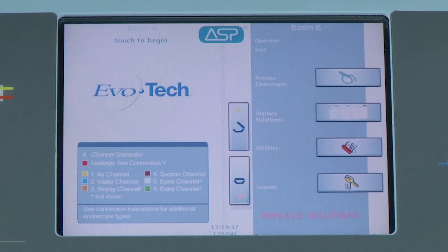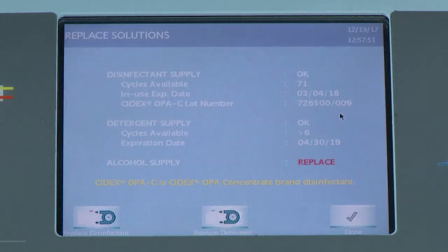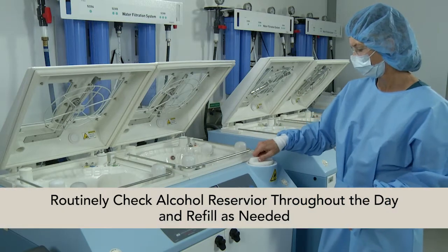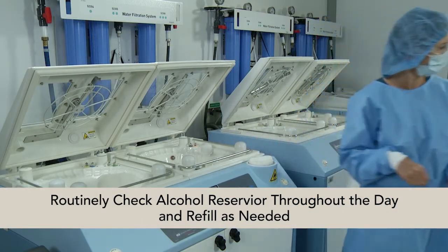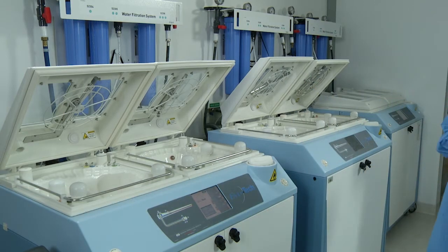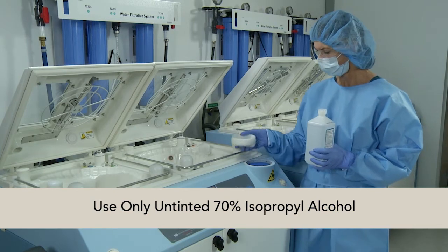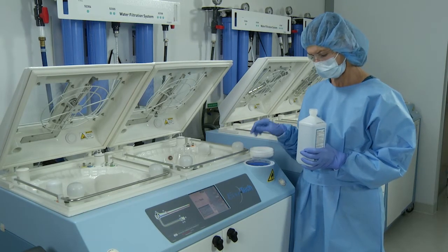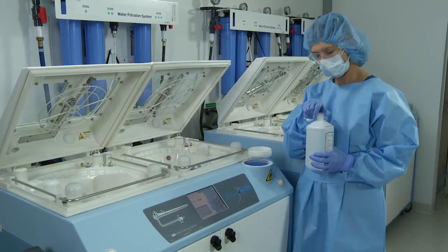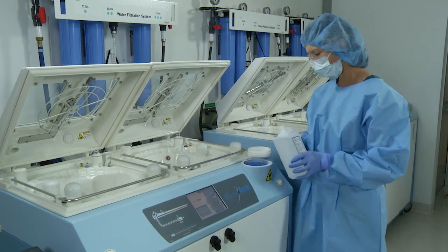The EVOTECH will alert you when the alcohol level is insufficient to complete a scope cycle. The best practice is to routinely check the alcohol reservoir throughout the day and refill as needed. Use only untinted 70% isopropyl alcohol in the EVOTECH. To replenish alcohol, open the alcohol port and fill until alcohol is at the fill line or about 1 inch from the top of the port.